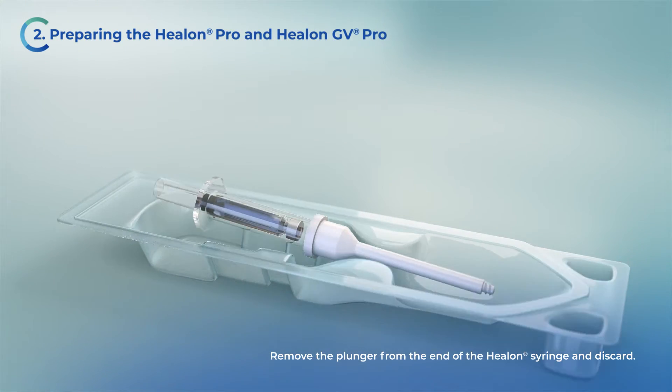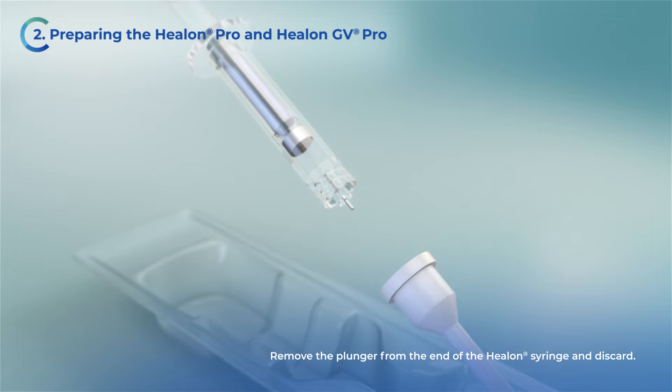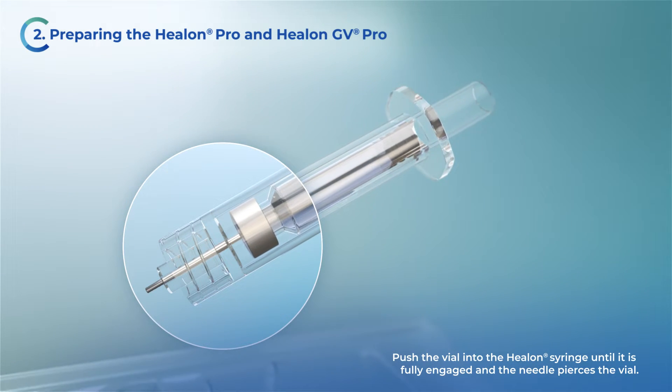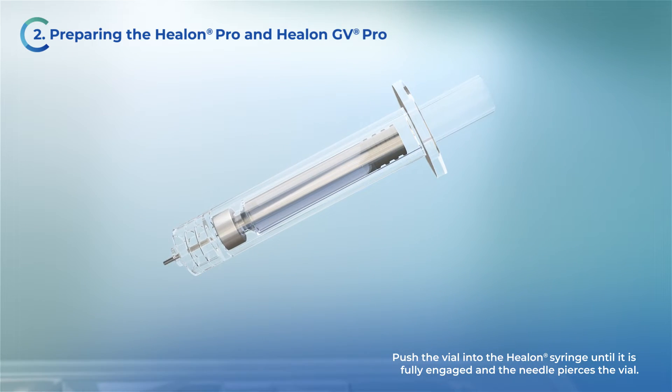To prepare the Helon Pro or Helon GV Pro, remove the plunger rod from the end of the syringe. Push the Helon cartridge into the syringe until it is fully engaged and the needle pierces the vial.